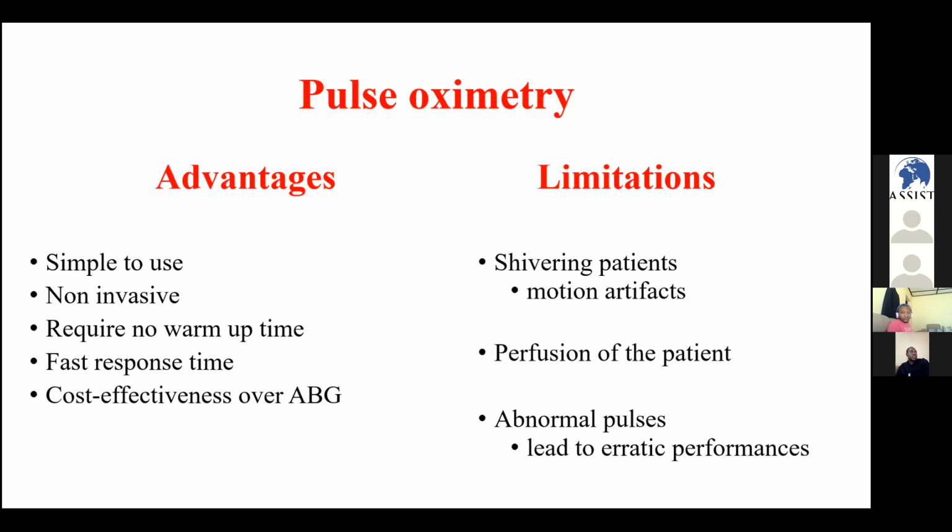So you don't need to do any warm-up to start using them. They provide readings in the first frame, and they are cost-effective compared to arterial blood gases or other tools you can use to detect hypoxemia.